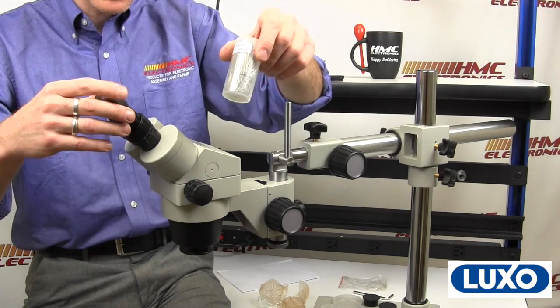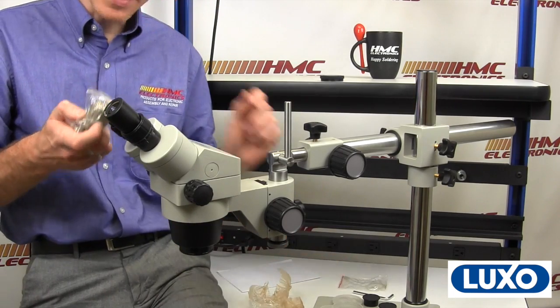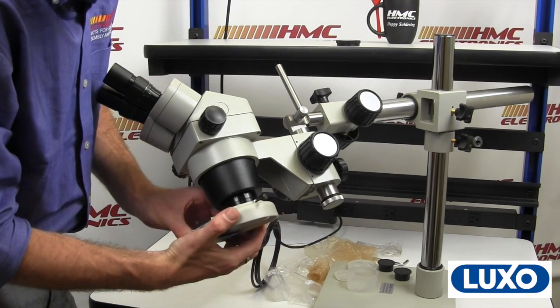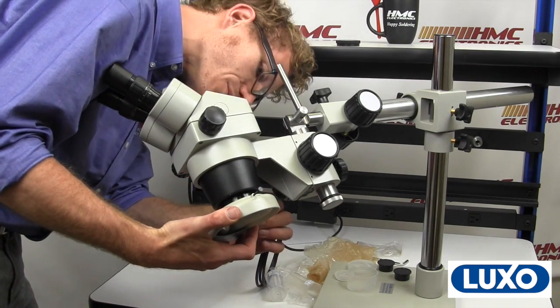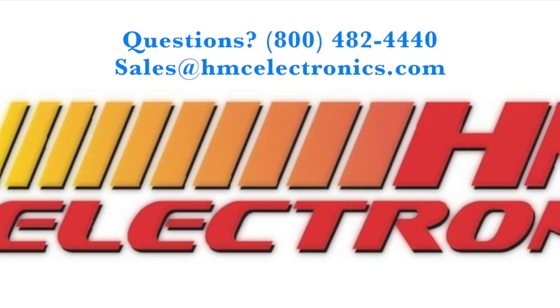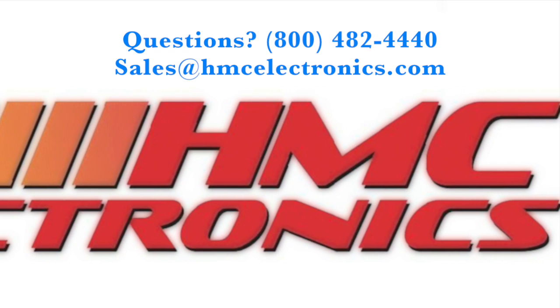Eyepieces are in these little tubes right here — unpackage them and just drop them in. We're going to drop them in for right now, and then we will go over attaching the light source. The model we have here came with a fluorescent ring light. Just as I discussed with this ring light adapter that came with it, we're going to attach these three screws into the groove right there — and we're in business.